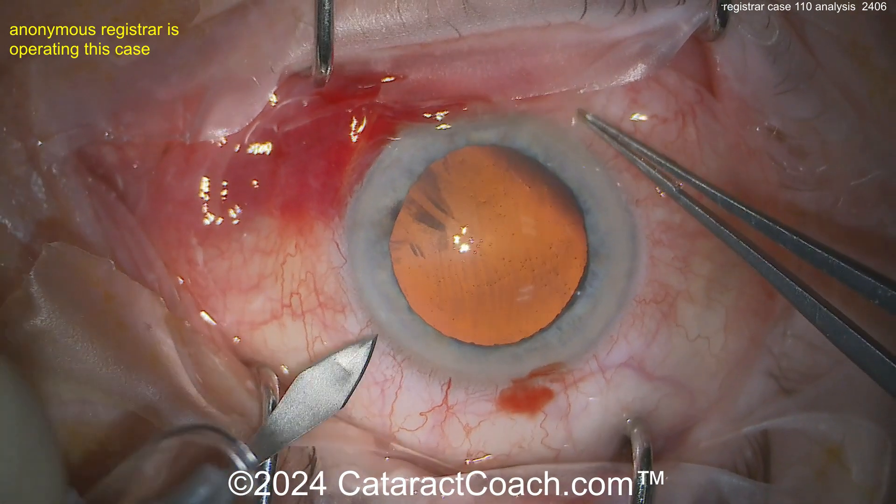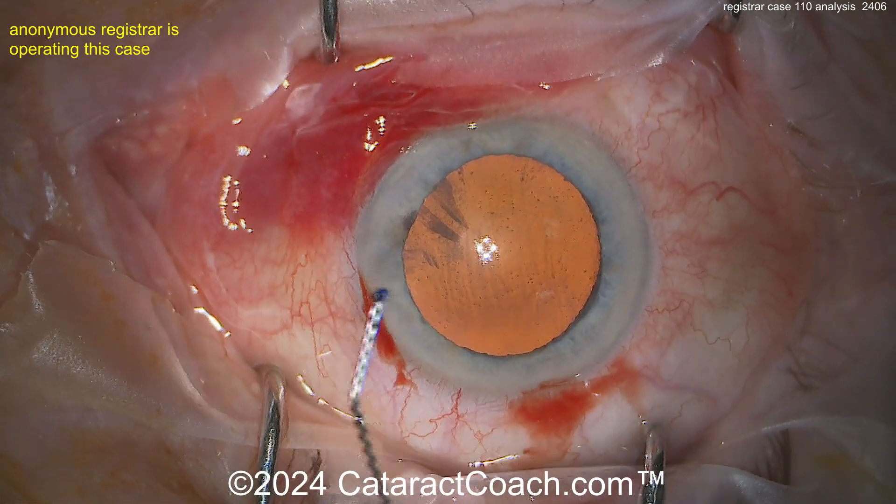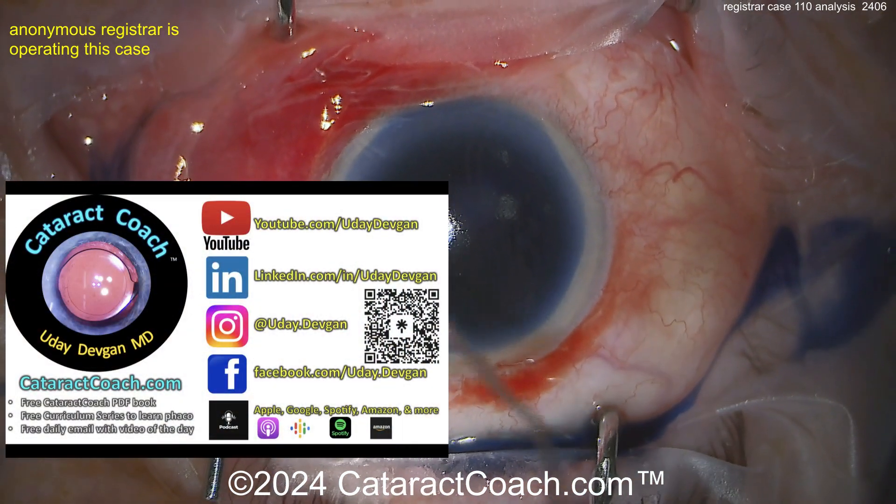Looks like a sub-Tenon's block was given — that's the sub-conjunctival injection we see there. Making a paracentesis and a keratome incision, and now here comes some trypan blue dye.